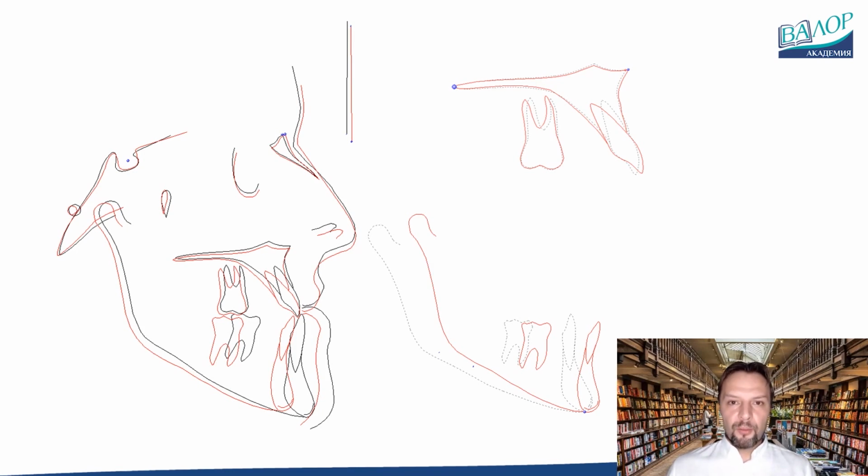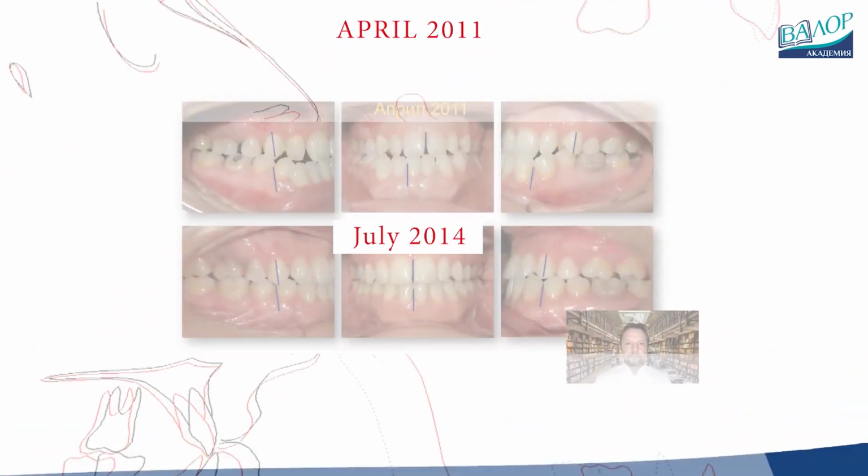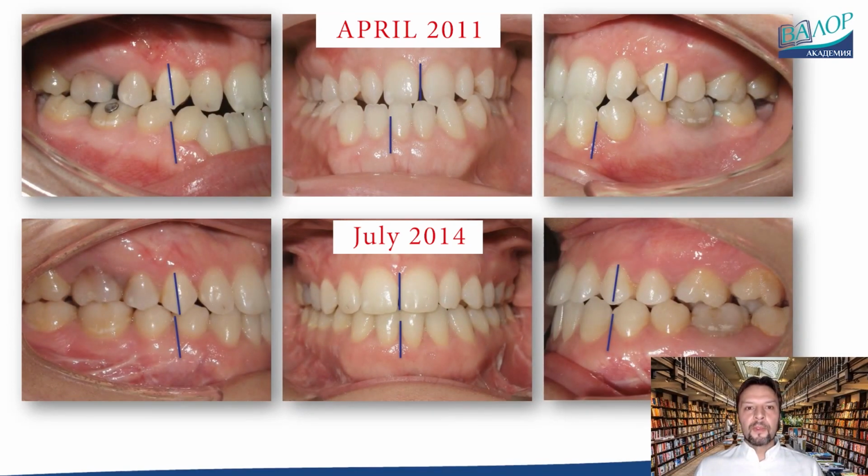Based on the upper jaw, we see the proclination of the incisors with controlled tipping, i.e., rotation around their center of resistance. In the mandible a dentoalveolar proclination of the incisors is noticeable. On this slide the change before the 2-year treatment and the retention control more than 1 year after treatment are compared. The blue lines are placed on the teeth that replace the canines to illustrate the canine class. The change in occlusion is also visible even to non-specialists.